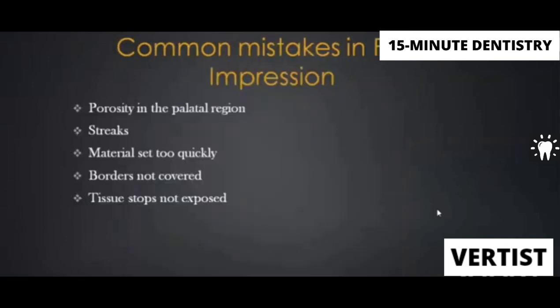Mandibular. Common mistakes in final impression, we'll quickly go through it. Porosity in the palatal region. This is very common. And I'll tell you, this is because you have not adapted your spacer properly on the cast. Sometimes the patient has a deep palate. When you are adapting, the spacer does not completely touch the palate. You have not heated the spacer properly and pressed it on the palate.